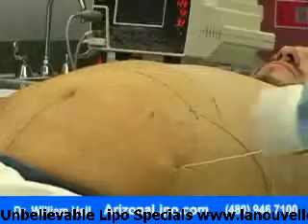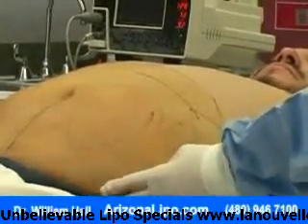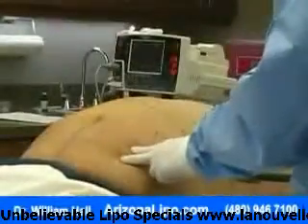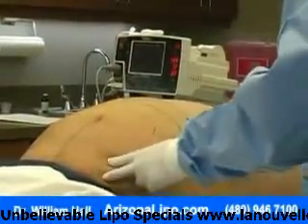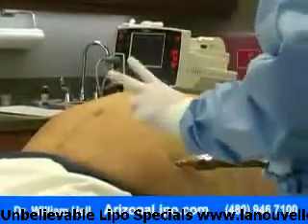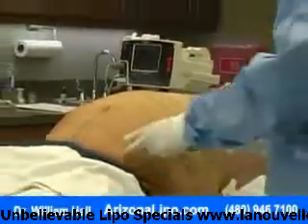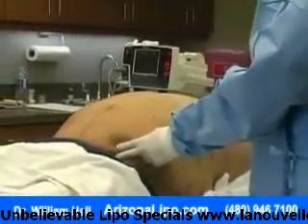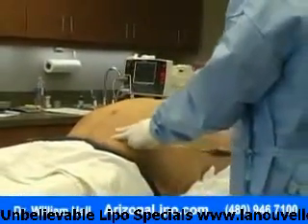And you'll mostly just feel a little bit of stinging sensation here and there, but not too bad, is it? No. This is a combination of the local anesthesia, the salt water, and the epinephrine that we talked about. So it's doing 2 things. It's numbing the area so you're not going to feel anything when we do the suctioning, and it's also constricting the blood vessels so that there's hardly any blood loss in this procedure.